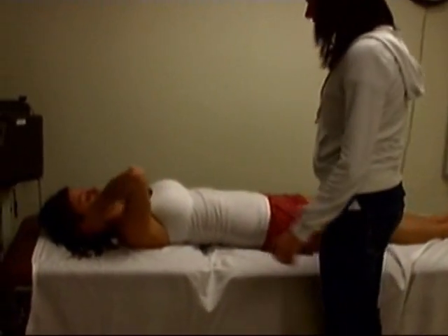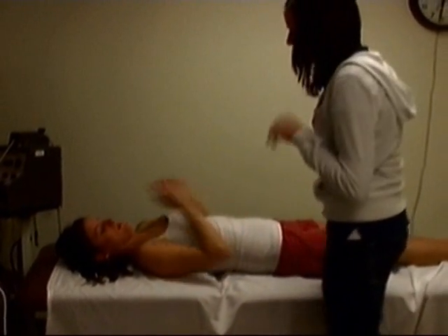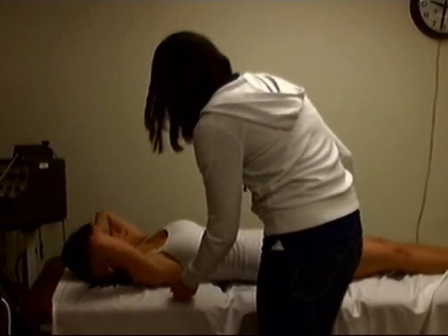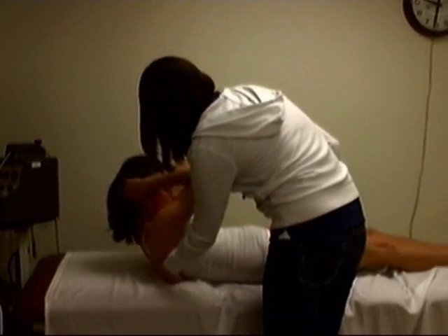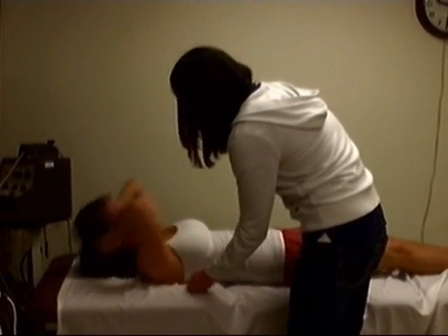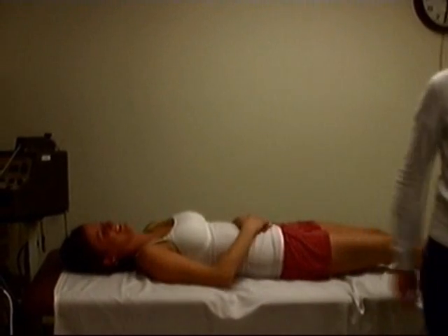You can go ahead and lay on your back. The next thing we're going to do is trunk flexion — it's just like a sit-up with your hands behind your head. What we're looking for is for you to clear the inferior scapula. Go ahead and come up and hold it. Let's do it once more just to make sure. That's a five out of five.